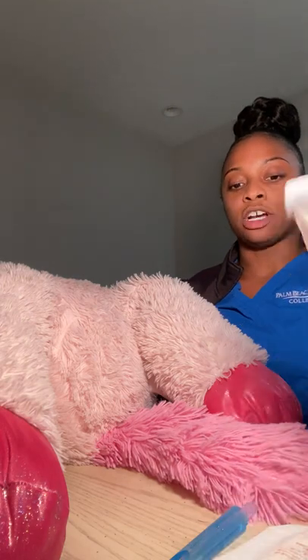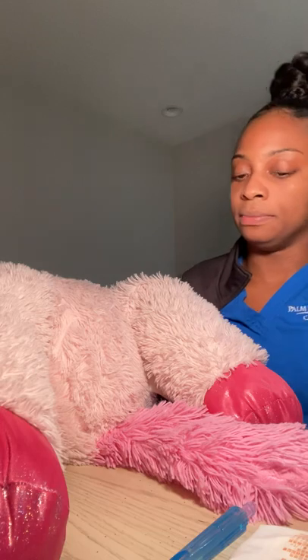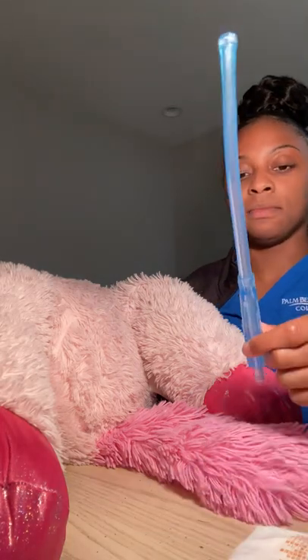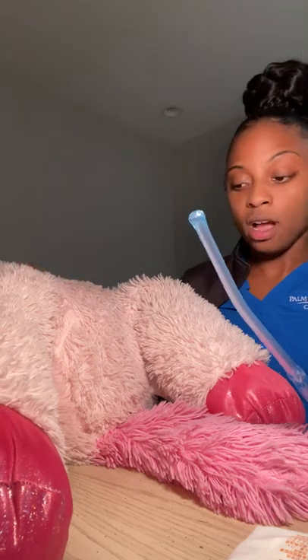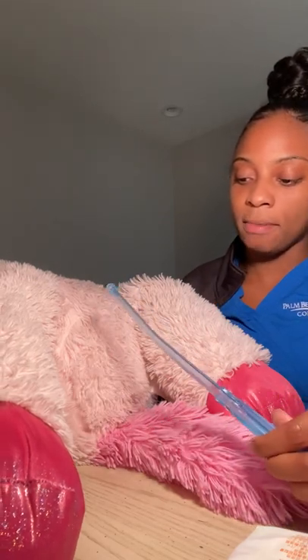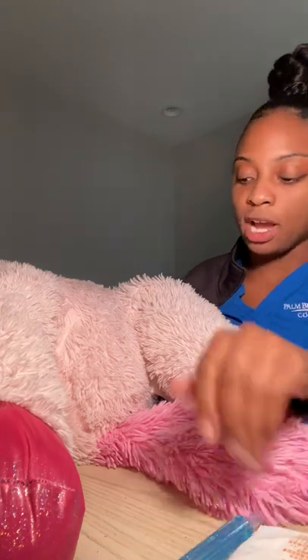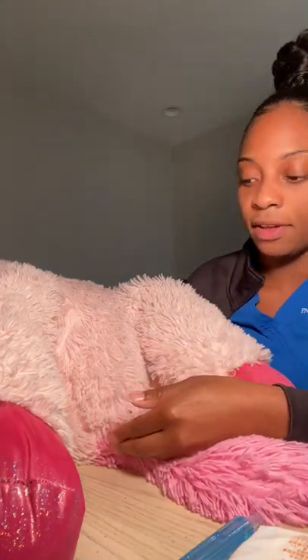My doctor's going to go ahead and put his sterile gloves on. He's going to ask me to hand him the tool, so I would hand that to him and just be there comforting my patient, making sure she's okay. Now that this has been inserted and the amniotic membrane has been ruptured, I'm going to make sure I am assessing the fluid and the drainage that's coming out, looking at the color of it.